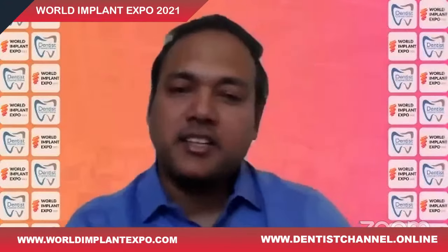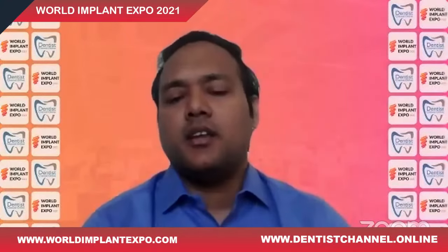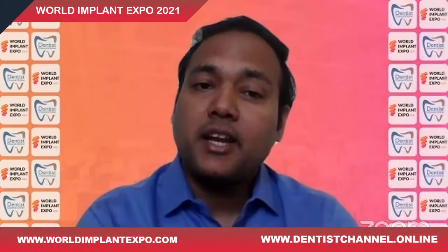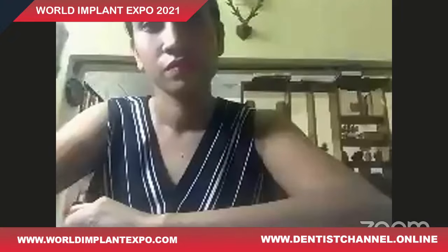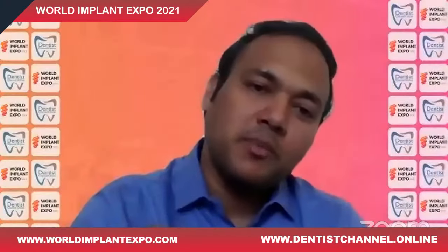As for contraindication, in situations where there is extraction and immediate placement, you don't need a CBCT, because you're going to extract the tooth, and it is free of pathology and periodontally uncompromised. When there is nice bone surrounding the tooth, you check the length of the extracted tooth and put your osteotomy 2 millimeters more than the measured length of the root. Then you can go ahead with simple radiographs, and that should avoid the use of CBCT. So in such situations, the CBCT is not recommended.